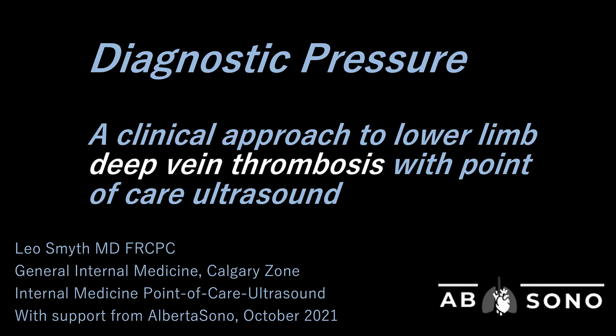Hello, my name is Leo, and this video is on the point-of-care ultrasound approach to finding thrombus in the lower limb deep venous system. This video will have two parts. The first will discuss the technical aspects of the exam and some pitfalls. The second will be an introduction to clinical reasoning.